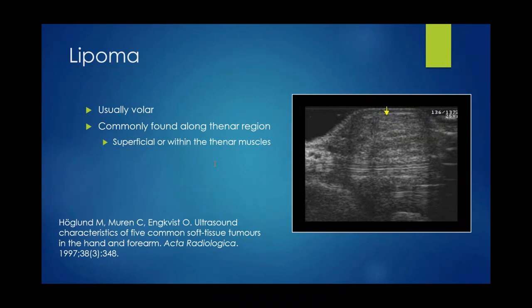And then we have one last. One last one. Do you see a difference in outcomes for carpal tunnel intervention between standard surgery versus ultrasound guided surgery? Right. So there's a number of studies looking at outcome measures.